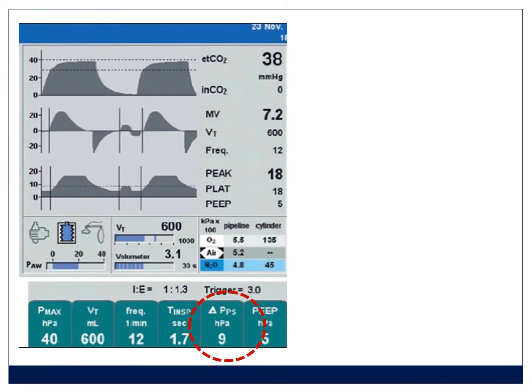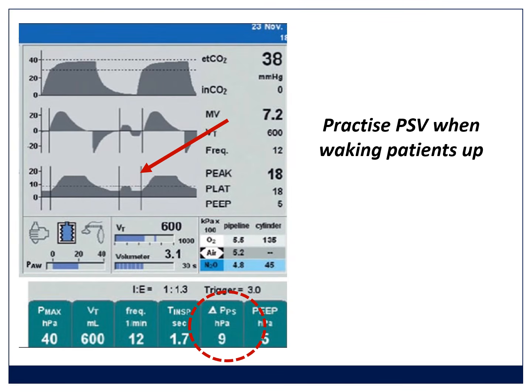pressure support. And those lines there that are on the pressure tracing, that indicates the patient trying to take a breath. And so you can see as the patient takes a breath on that one that the arrow is pointed to, the ventilator then assists that breath with that pressure. So that's called pressure support. That is SIMV plus pressure support.